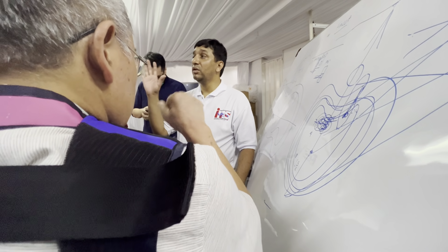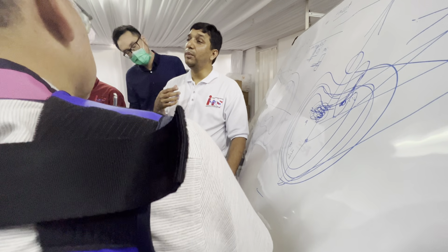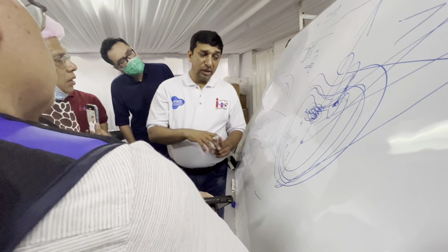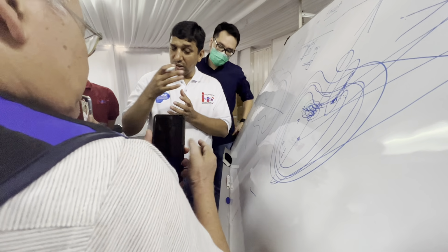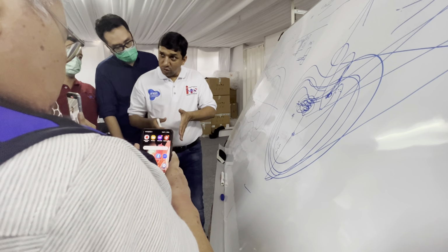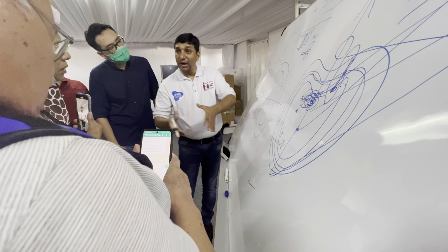For transforaminal, what you can do is start by putting the needle. You do the same thing, but instead of doing the epidural transforaminal injection, you do the injection in the disc. If you inject into the disc, it will take the same path as the inflammation. Once you put the medicine inside the disc, it fills the disc, then goes to the annular tear, then to the PLL, then to the epidural space and to the nerve root. So this takes care of the same path of inflammation.